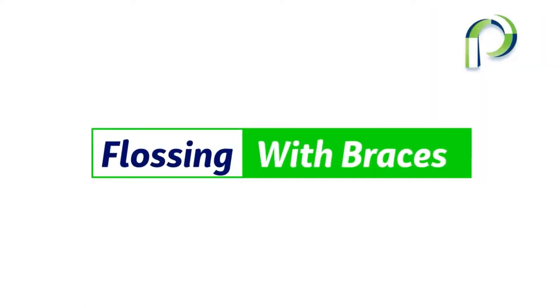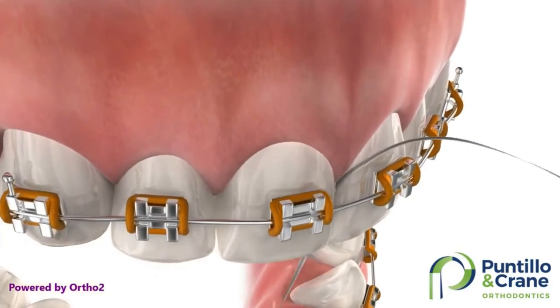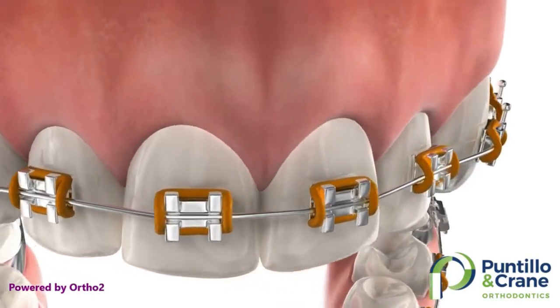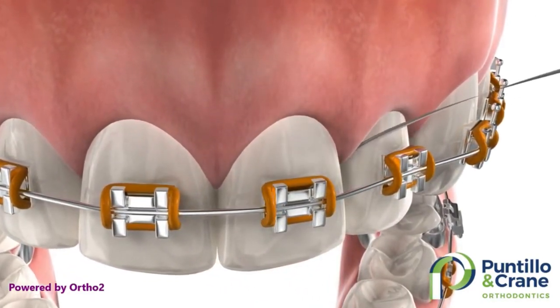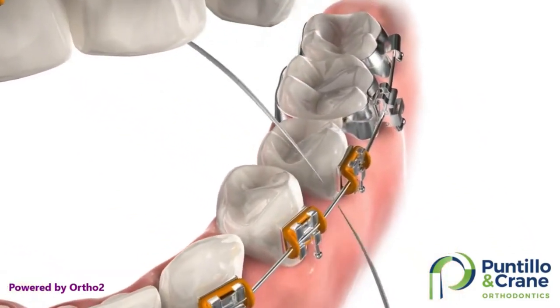Let's go over how to floss with your braces. You'll need to thread the floss under the arch wire. To do that, we have included floss threaders in your home care kit. Start by threading the floss through the loop in the floss threader, then thread the floss threader under the arch wire and gently go between your teeth, hugging the sides of each tooth. Do this between each tooth.